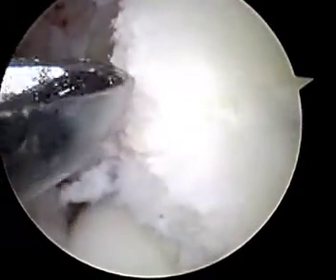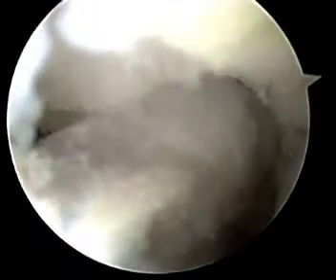Shaving of synovitis and arthrofibrosis affected tissues was done with a radiofrequency system. Additional resection of the fragment was performed with a punch. When it was difficult to determine whether the fragment was being correctly resected, the position of the instrument was confirmed with fluoroscopy.